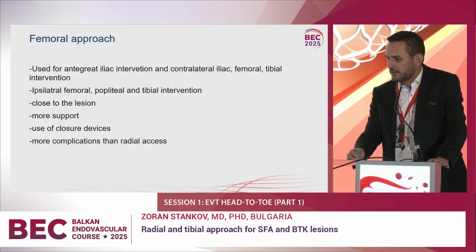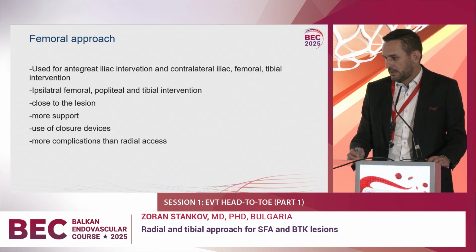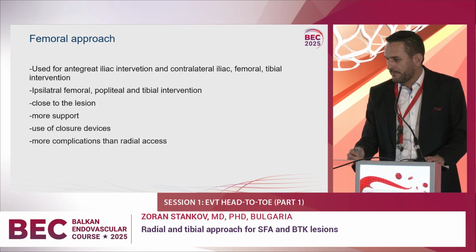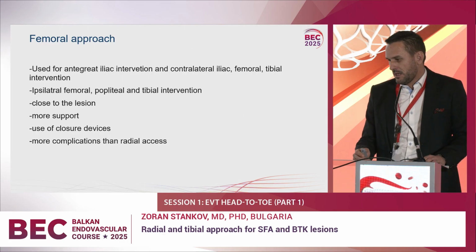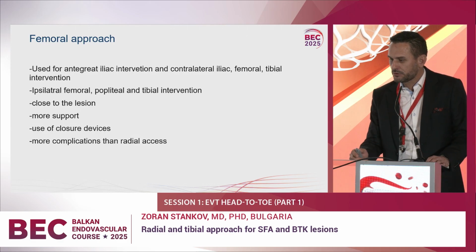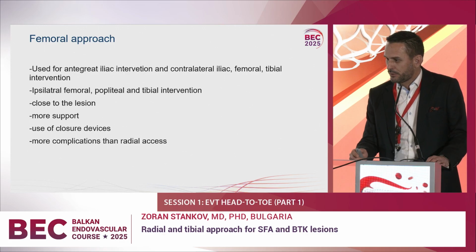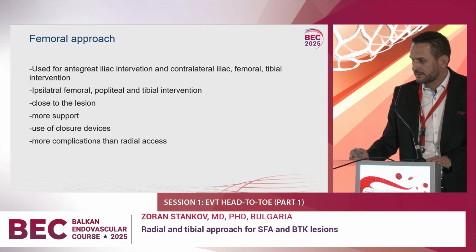Regarding closure devices, the femoral approach is the only one with most closure devices dedicated for it. We can use all of them: Angio-Seal, MANTA, Prostyle, everything is dedicated for the femoral approach. We use the same devices for other approaches, like the brachial, but it's off-label. For carotid, using a closure device is still off-label.